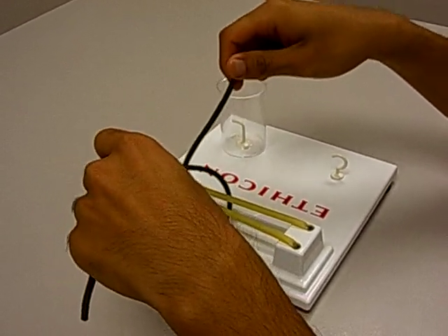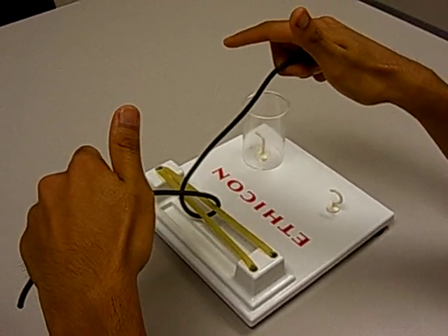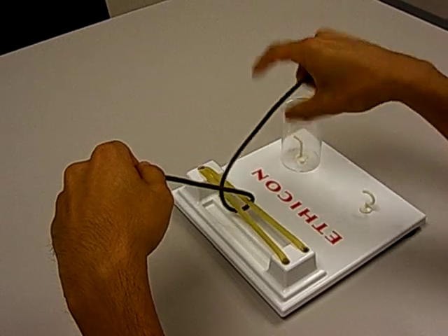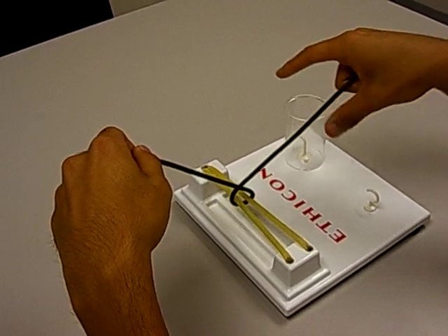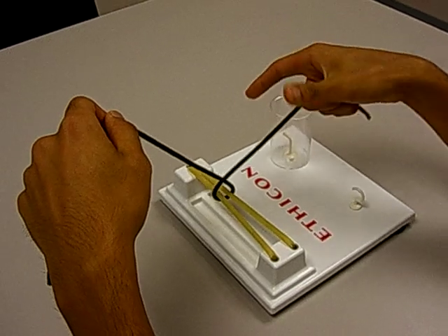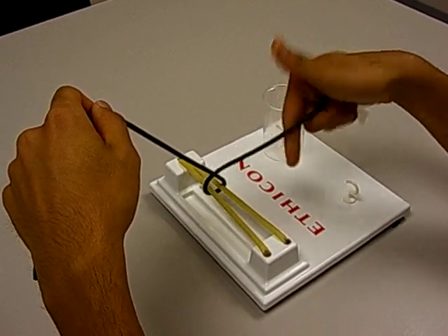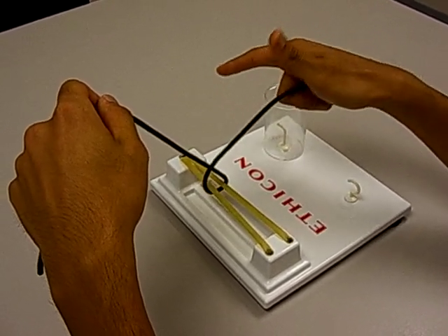So this is your starting position — you always want to start like this. Now let's talk about making a square knot. You want to make a loop with either your index finger or your thumb. For the first throw you're gonna use your index finger, and for the second one you're going to use your thumb, and you keep alternating between your index finger and your thumb for each new throw.